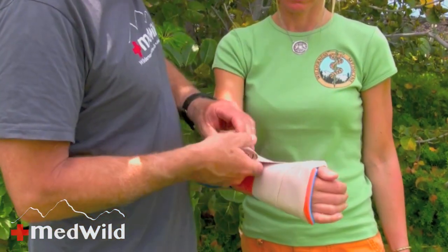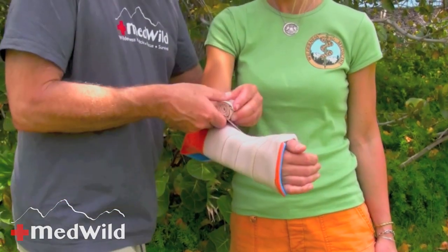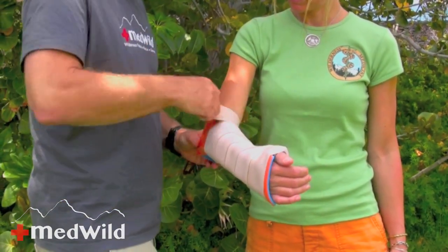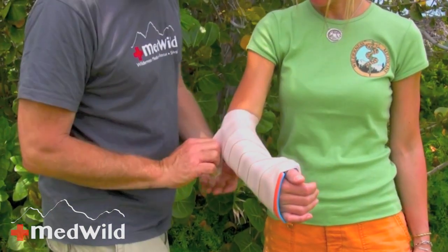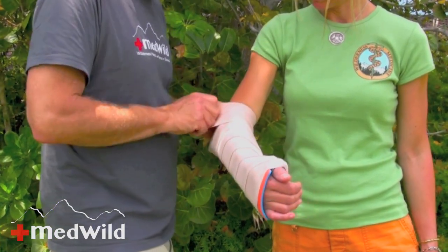Then I just start doing a diagonal style wrap. When I get to her elbow, I put a couple of extra wraps in because we're really going to be molding that elbow in a moment, and I want that area to be well contained.